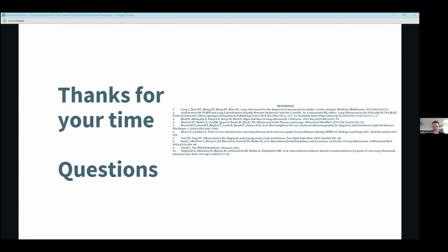I like Kev's question about curvilinear in an abdominal setting is better, and the lung setting looks weird. I totally agree with you, Kev. My approach is to use the linear on a lung setting in the anterior zones, because I find the curvilinear in the lung setting is really grainy. I know all of the filtering and stuff's been taken off it because it's a lung preset, but I find it a lot easier to differentiate what I'm looking at with the linear probe.